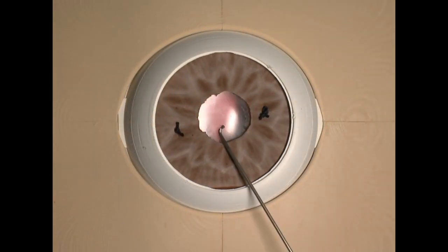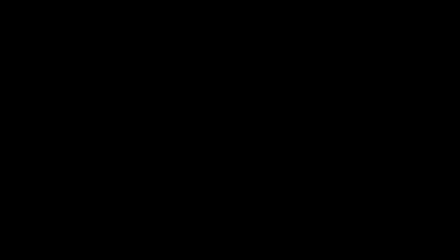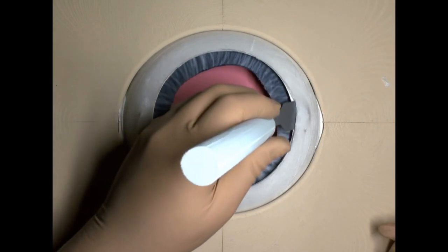In sclero-fixation by suture, the knots must be either buried or placed under a flap. Flap can be constructed from limbus.